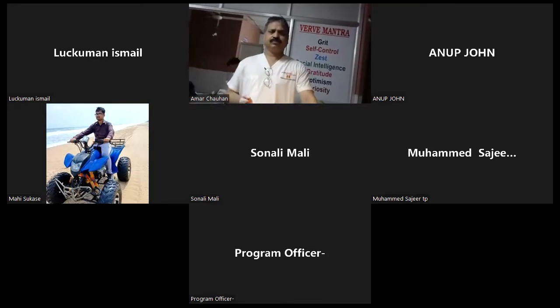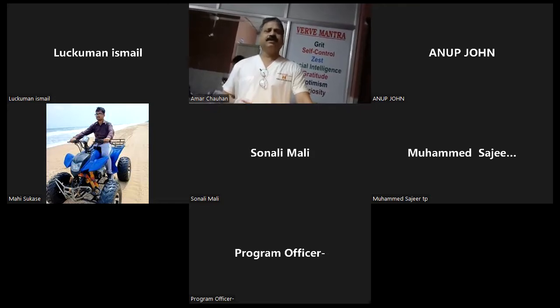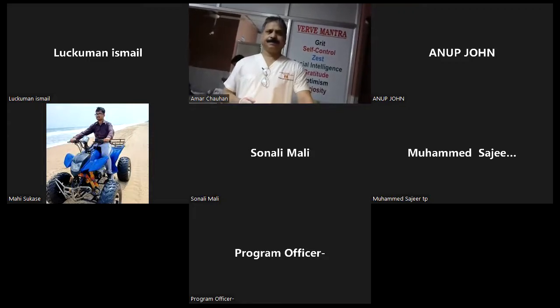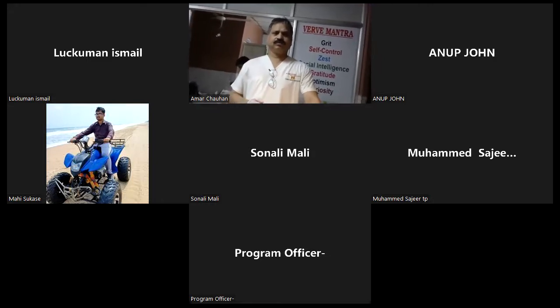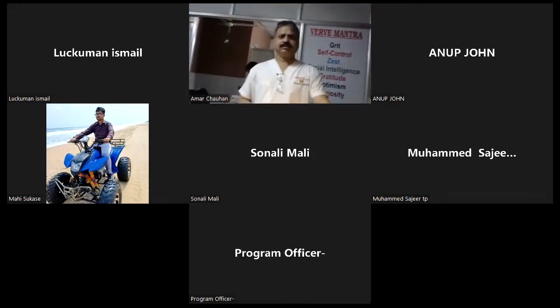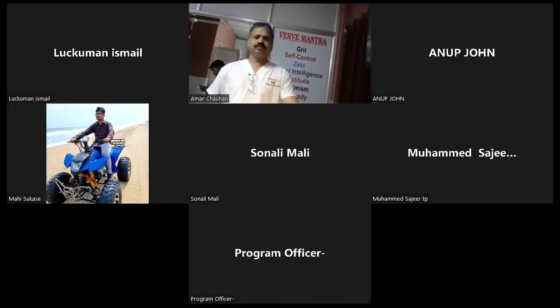But one more thing: we have not gone into the detailing of this mannequin. Is it possible to go through the specifications provided by the company one by one? Lukman will give you those. I'll read out the specification and sir will explain it. We can start with this ICD.